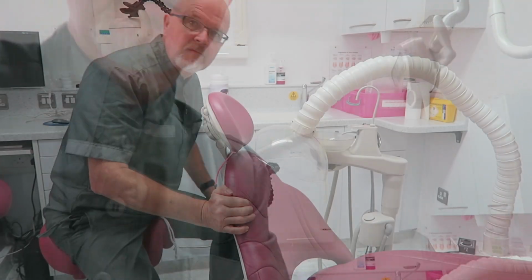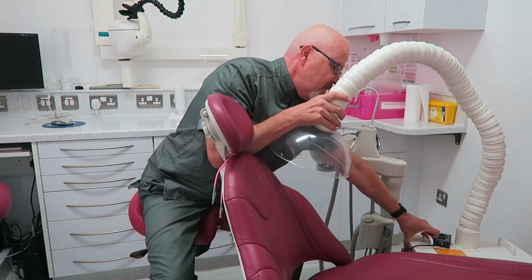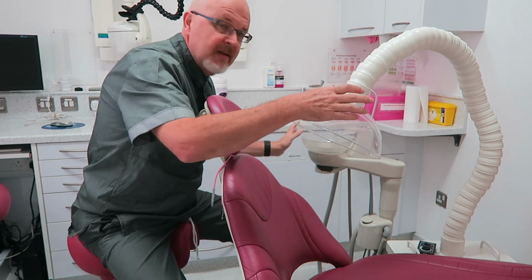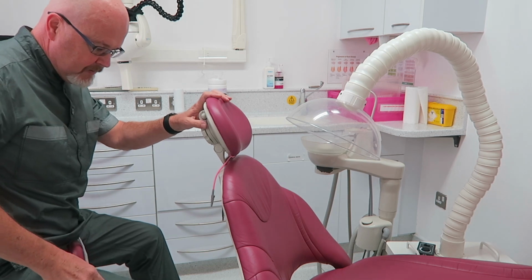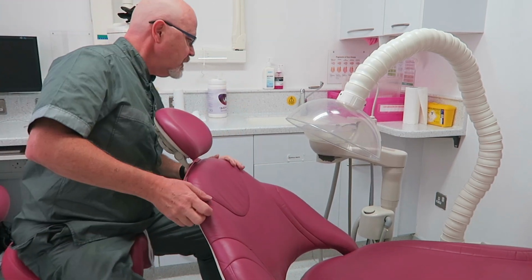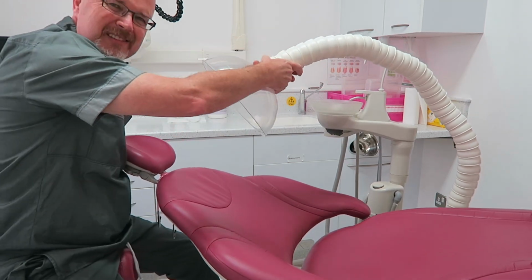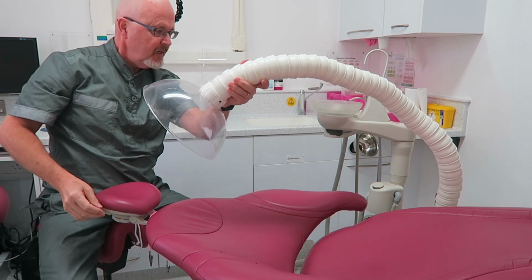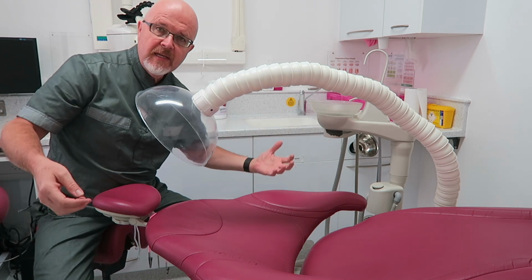So let me just set this down. Right, so as you can see, if I do pull this forward into a position there, it means then the nurse has to come around the back. If I put the chair down into a position where this will actually go, right, okay, well that works quite well.